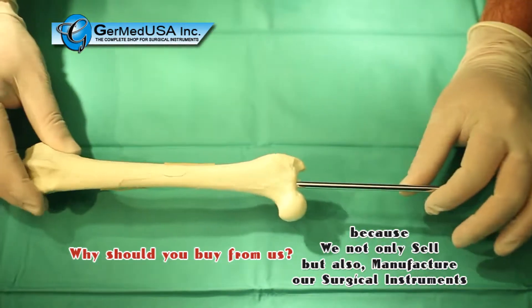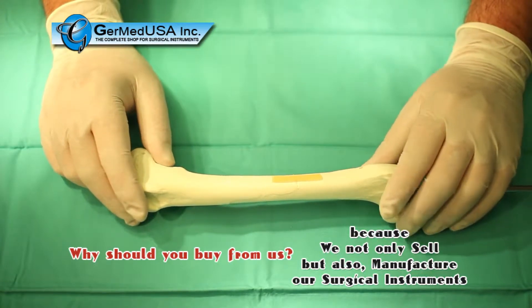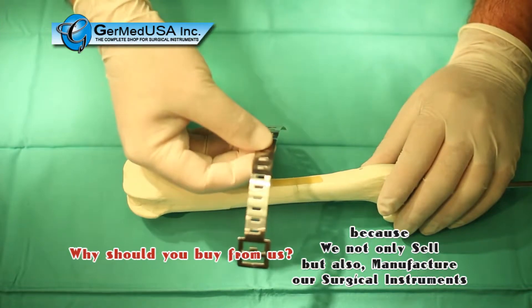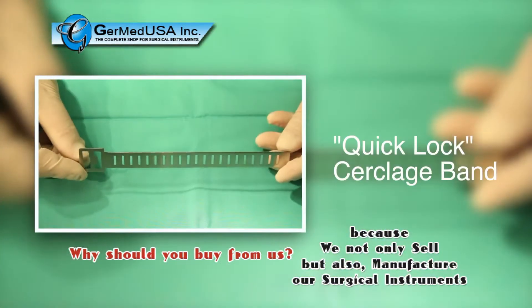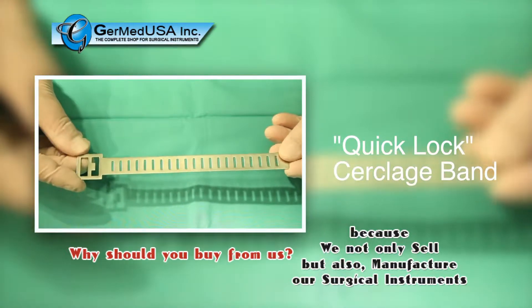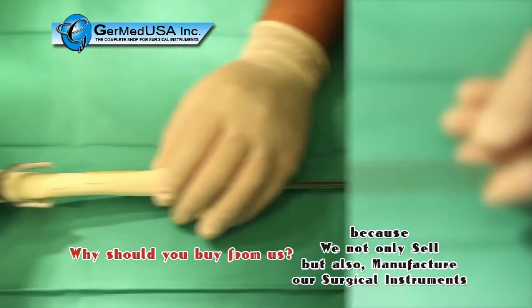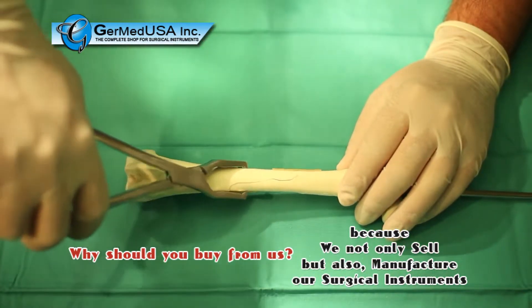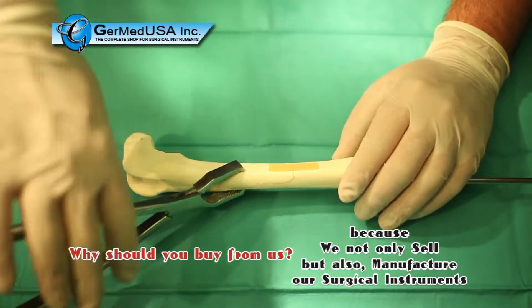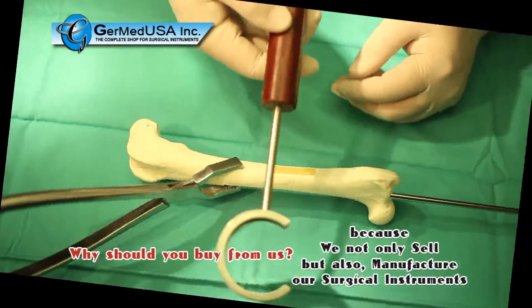This model shows an IM pin already in place. The next step is to add the QuickLock Circlage Band. Once anatomic reduction is achieved, the fracture fragments are held in place with either pointed reduction forceps or, in this case, a Kelly bone-holding forcep. The passing guide will be used to pass the band around the bone without entrapping soft tissue.